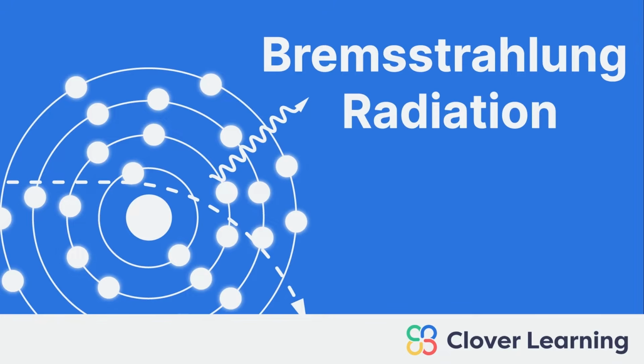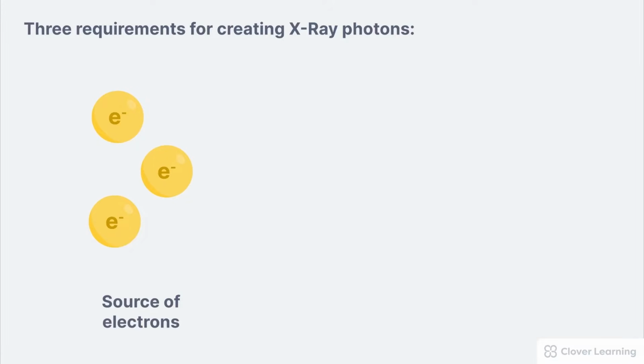Everybody, welcome back. This video is an overview of Bremsstrahlung radiation, one of the target interactions that creates X-ray photons in the X-ray tube. First, let's remember there are three essential requirements for creating X-ray photons.